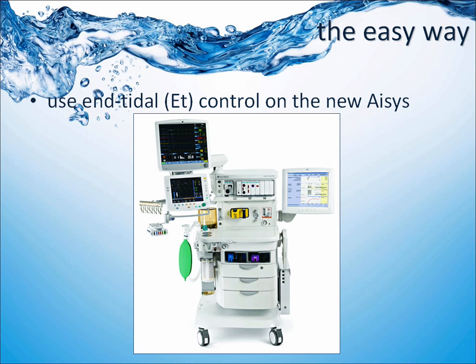And the easy thing about it is that it has hypoxic protection, which means it will calculate and deliver the right amount of oxygen required for your patient. So you know that you're not delivering a hypoxic mixture when you're running low flows, because it's analysing how much oxygen is actually coming out of the patient. The other ideal feature is, as I mentioned, it has a purge function at the end, so that you can wash out your volatiles very quickly at the end.